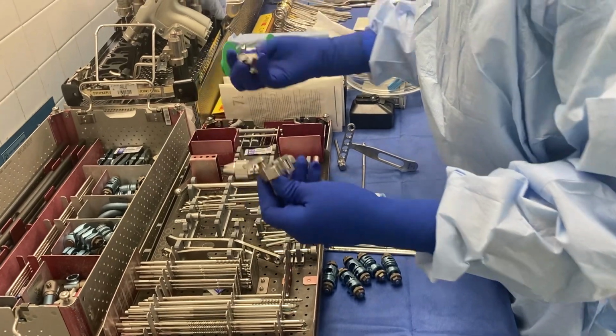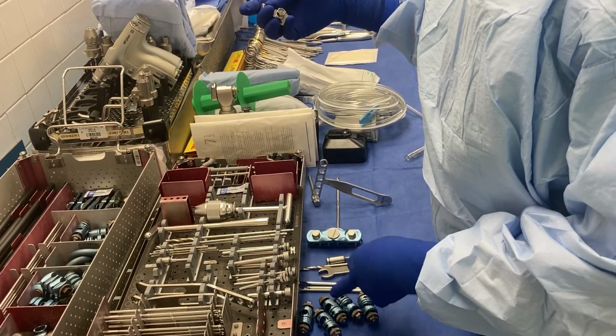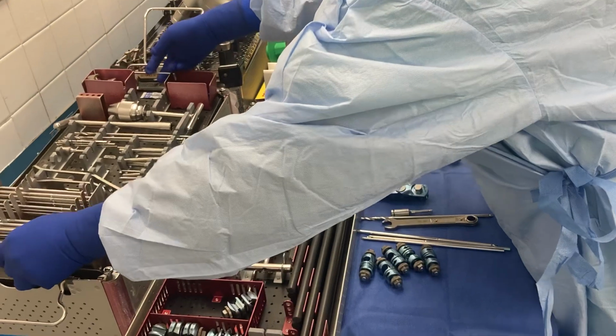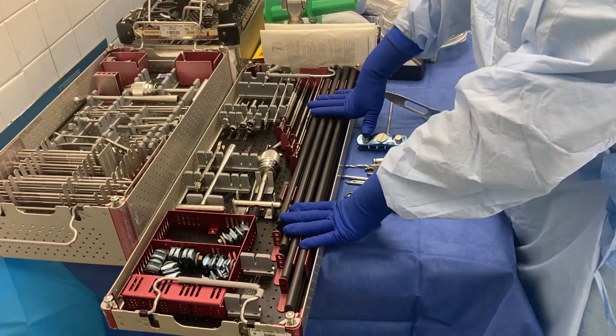And they usually use them in combination. So they'll put one on one side of the bar and pin, and then they'll put one on the other, and they'll tighten them down. So that's pretty much it. And this is the same tray, but it's just longer stuff. And that's it.